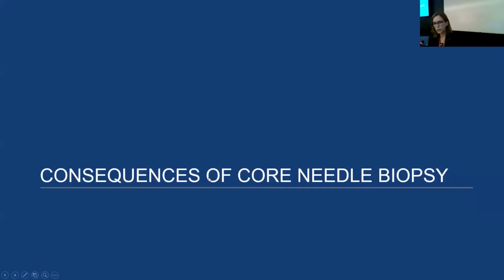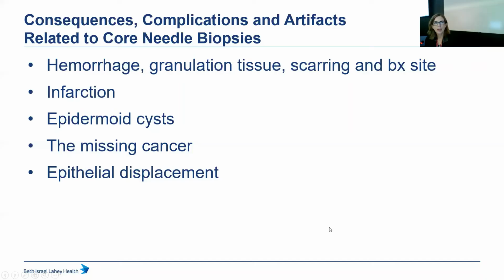So moving now to discuss some of the consequences of core needle biopsy. I talk about this a lot, and I often think, well, we're all aware of this now, but I was telling Eddie that I just came across a case where this was missed. So I think it's important to review and reiterate some of the complications of core needle biopsy.